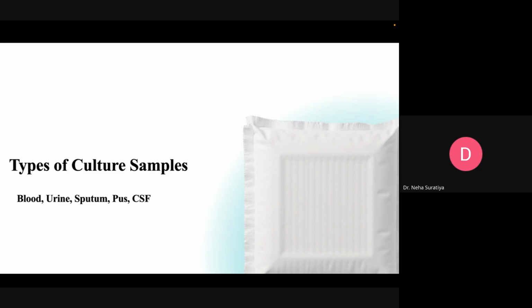And sample क्या हो सकता है? Again, CSF भी हो सकता है, which is cerebrospinal fluid. That can be used in cases of meningitis, for example, or it can also be an emergency sample, guys.